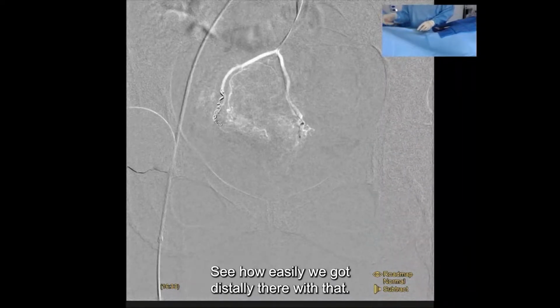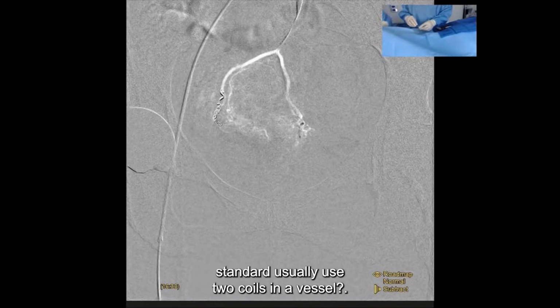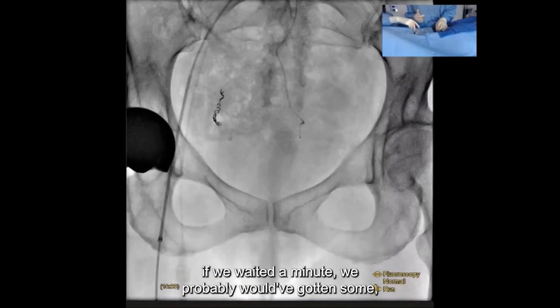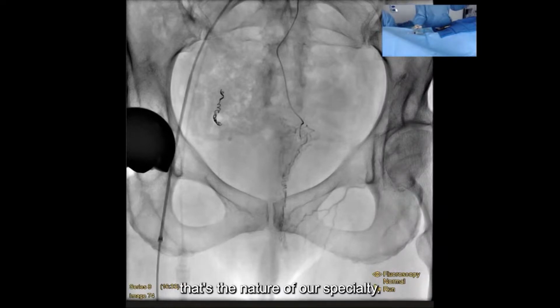That's how easily we got distally there with that. Now, what about coiling? When you coil, is it standard to usually use 2 coils in a vessel? Typically I'll use 2. Standard? Yeah. I mean, as you know, patients of the interventional radiologist, if we waited a minute, we probably would have gotten some. But it's impossible for us to wait because that's the nature of our specialty.